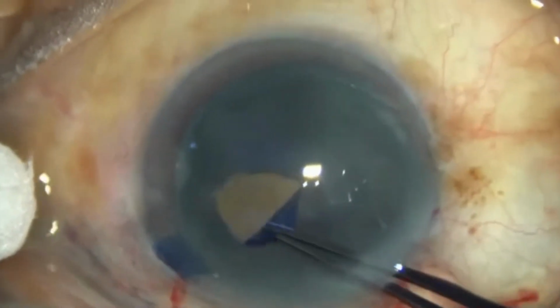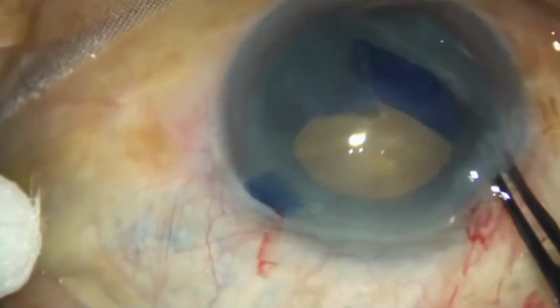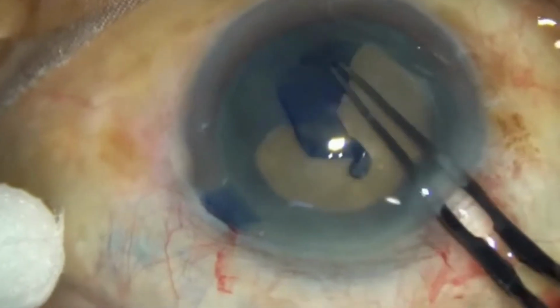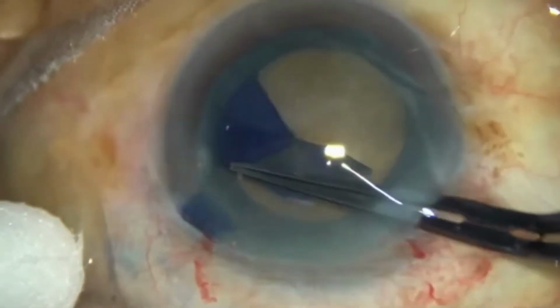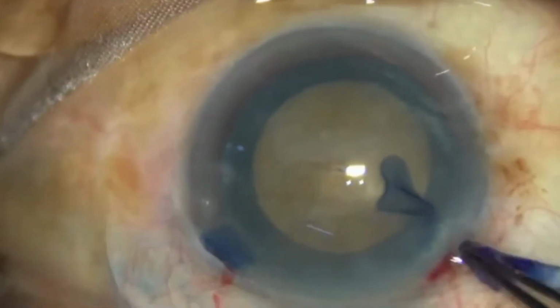In the event of peripheral extension of a tear, rhexis forceps can be used to change the direction of the tear. By holding the torn flap of the capsule as near to the base and pulling it toward the center of the pupil, peripheral extension of the tear can be prevented.